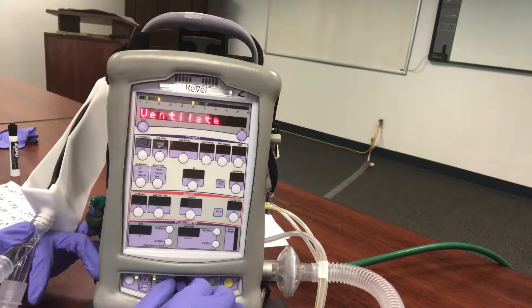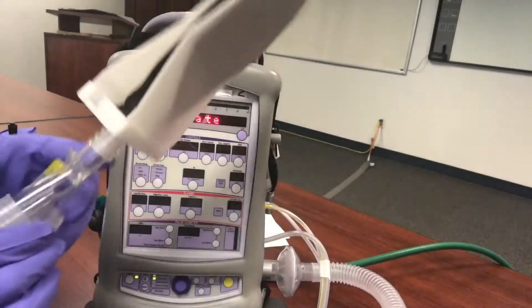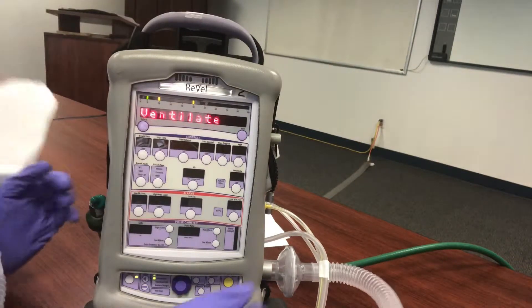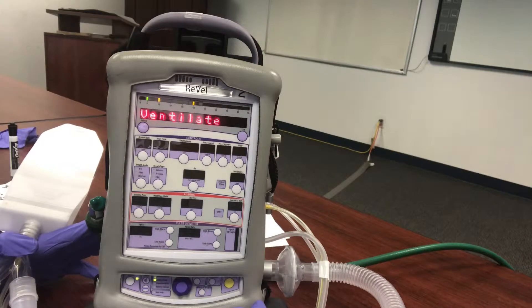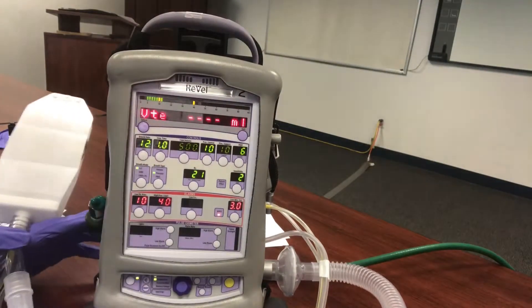Then we have the Ventilate button, which gets it started. Make sure you're all dialed in before putting the patient on the mask. Make sure the mask is a non-vented mask. It's best to use your own equipment — try not to use whatever the hospital gave you, because you don't know for sure whether their mask is vented or not. As a safety measure, I recommend using whatever you brought.